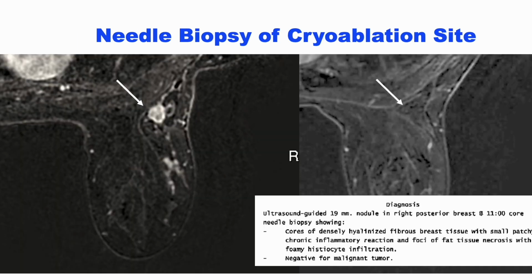Here's a pre- and 3-year post-cryoablation breast MRI showing no residual mass. I mentioned that previously. This same patient underwent a core biopsy of the cryoablation site 6 months after cryoablation, and the pathology results showed fibrosis, chronic inflammation, fat necrosis, but no evidence of residual malignancy.